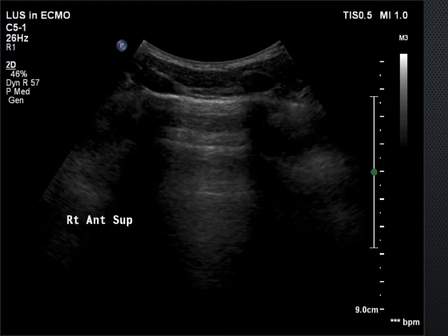One of the most important aspects in order to distinguish that that is in fact the pleural line that you're looking at, other than the fact that this one's actually moving, sometimes they're not, and that's just as informative as it moving, is you want to identify some structures around it. And that's where we talked a little bit about the bat sign before.